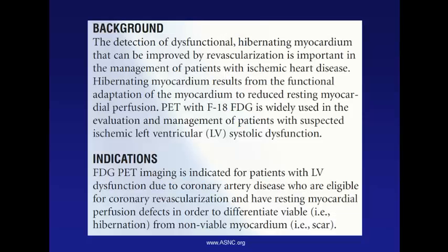Now, I took this slide here from the ASNC, from the American Society of Nuclear Cardiology website. There is what they call a practice guidelines card, where they give you a little bit of background and some indications, and also a little bit of advice for technicians also how to run a cardiac PET, and I think that's certainly an interesting source.